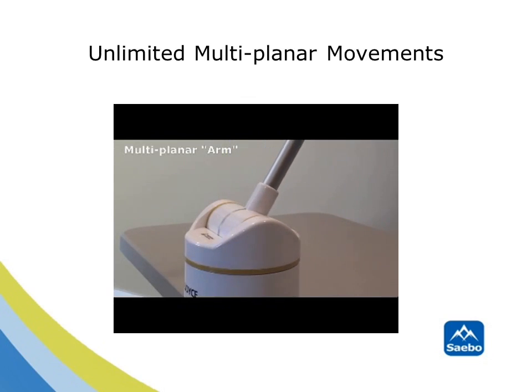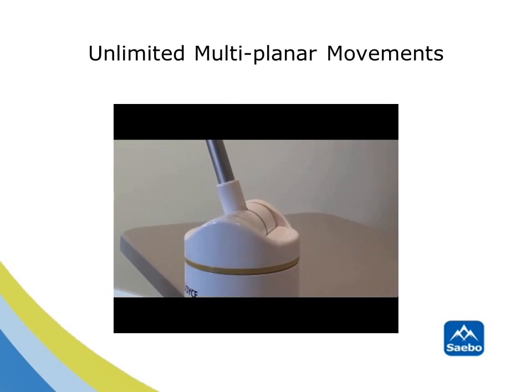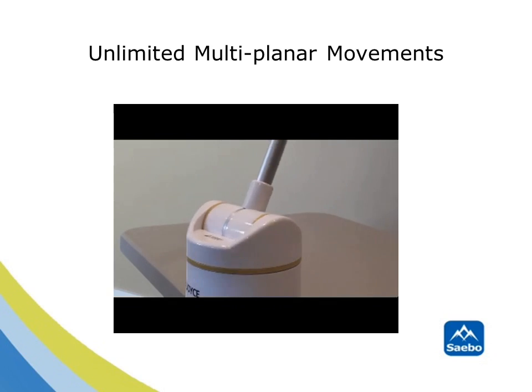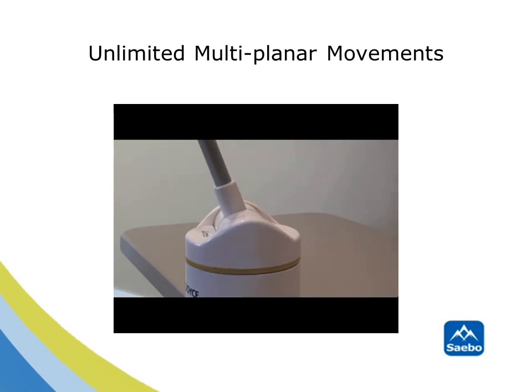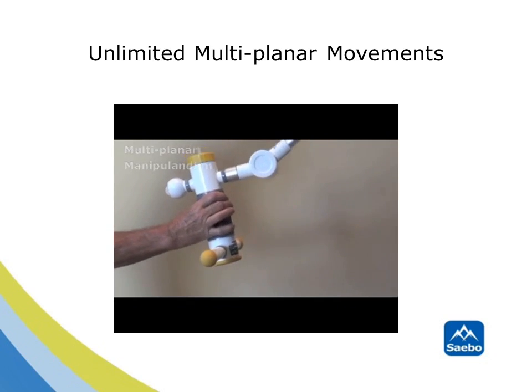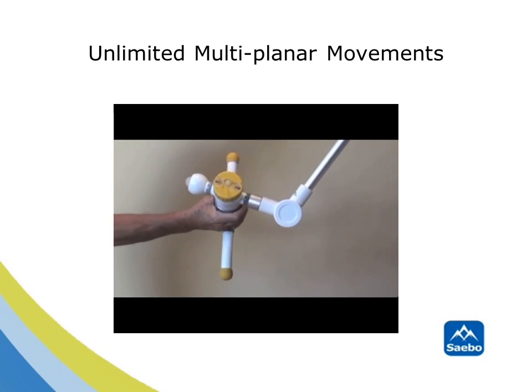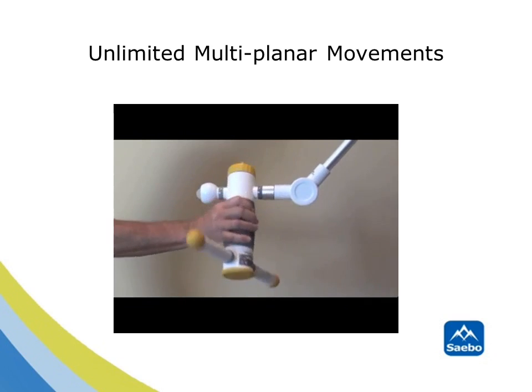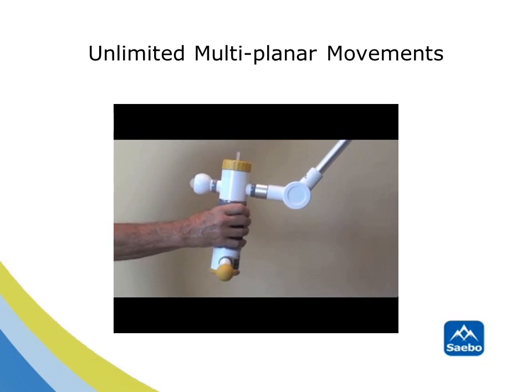To maximize training as well as provide accurate simulation of tasks, it is essential that the SABO Rejoice arm is fully capable of moving in all planes possible. As you can see, the base of the SABO Rejoice arm is capable of all multi-planar movement. In addition, the manipulandum also is able to move in all planes as well. This freedom of movement not only allows for unlimited functional planes to practice in, but provides a more realistic environment for training.